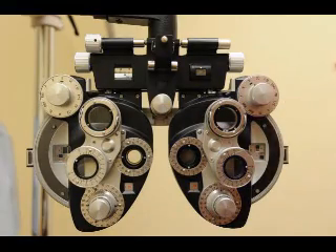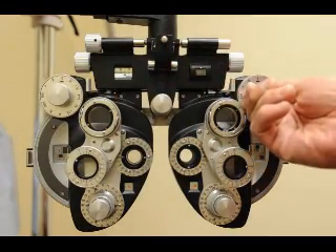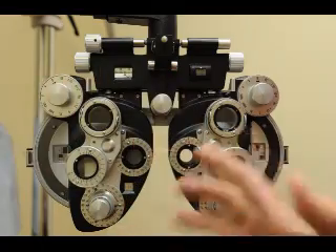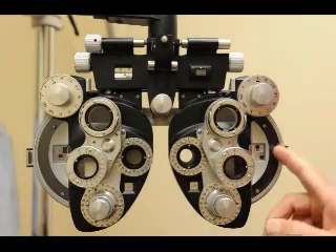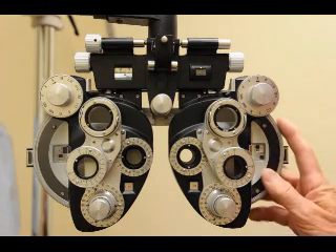Now do the left eye. Open the left eye first, then close the right — do it in that order so you don't leave the patient in the dark. The left eye has plano from the autorefractor.